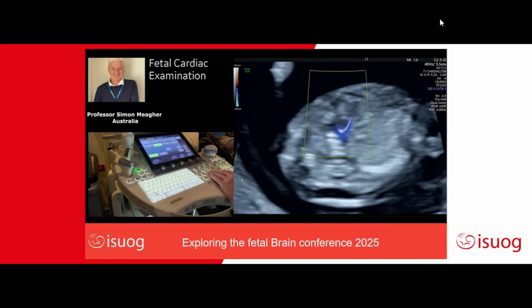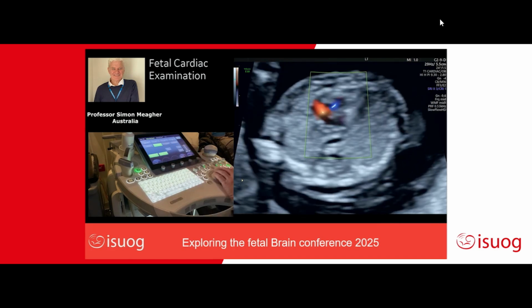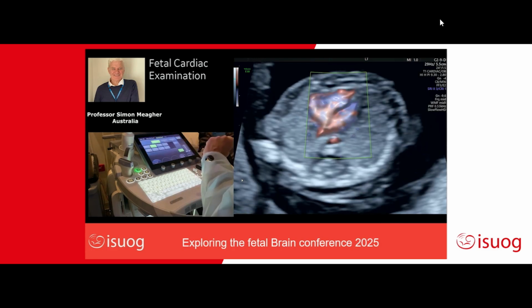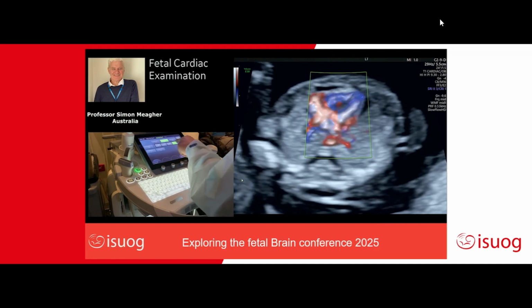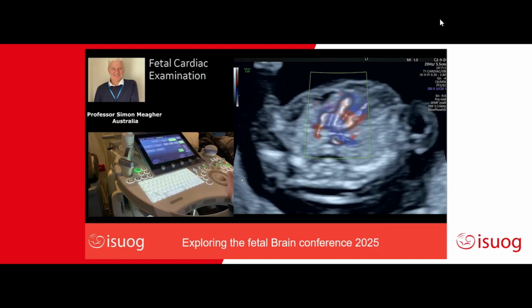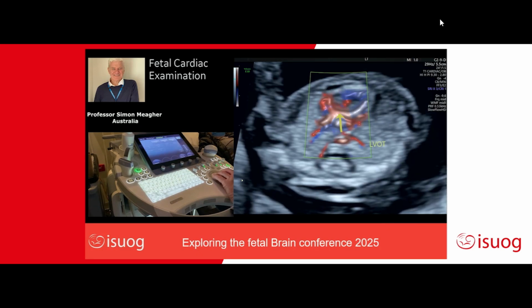And that's frequently the case with power Doppler in the first trimester, which takes us now to the slow flow technologies. Now, slow flow, the first thing I do is I select a map of 4. I leave the background as on, and then radiant flow I put to max. And you'll see as soon as I do that, that I get my left ventricular outflow tract. So there's the aorta coming out of the left ventricle.